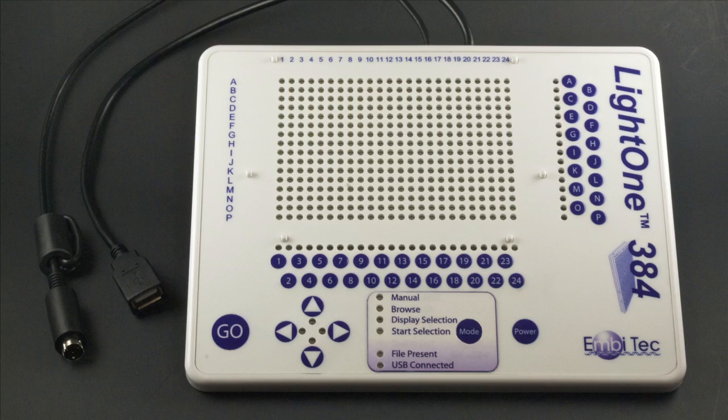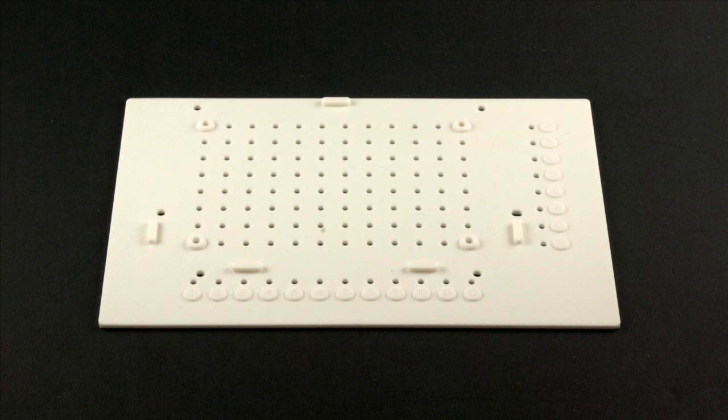The LightOne unit has two connections: one to the junction box for power and the foot pedal attachment, and one for USB. The LightOne's display is set up for 384-well plates, but can be modified for use with 96-well plates. A white silicone 96-well adapter is included with each LightOne.